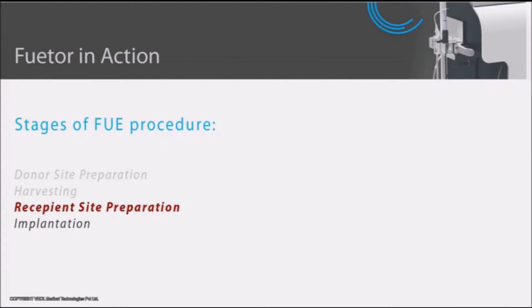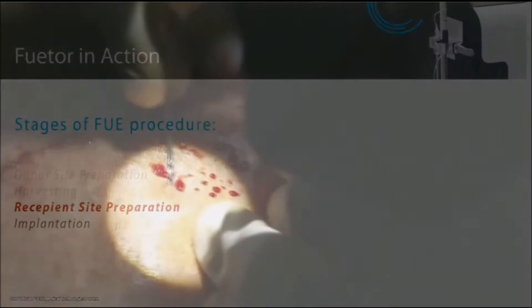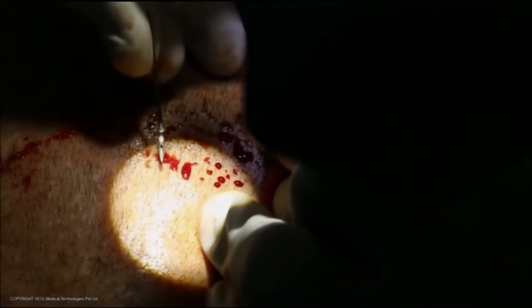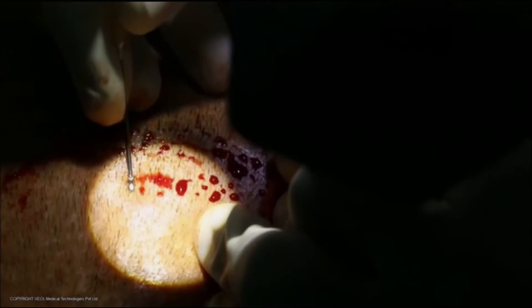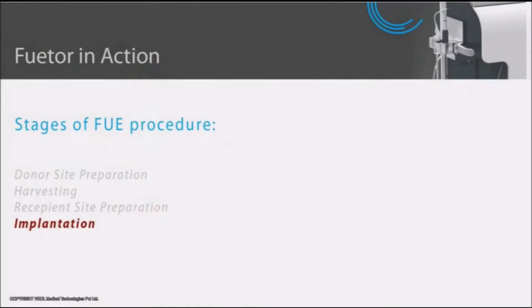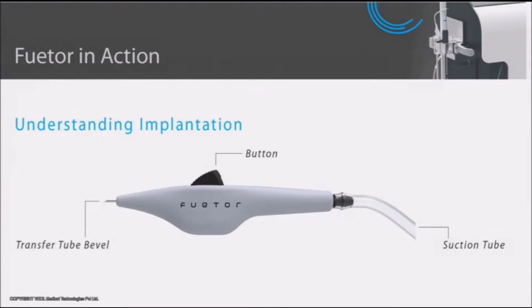Once the grafts are ready for implantation, the recipient site is prepared by administering anesthesia and creating slits using a hypodermic needle or a micro blade. Implantation can be started once the slits are prepared.